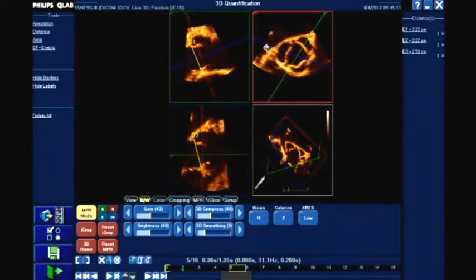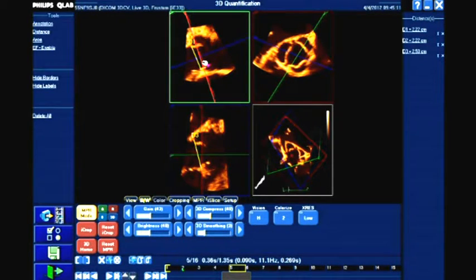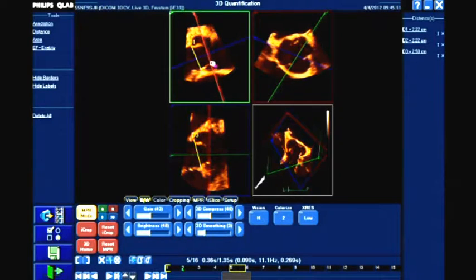And the way, again, I like to do this is to move this red plane, almost like a short axis view, up and down, away from the aortic valve, into the coronary sinuses until I can see the origin of the left main. So if I just do that now, as I move it up, I can just see that left main coronary artery coming into view here.